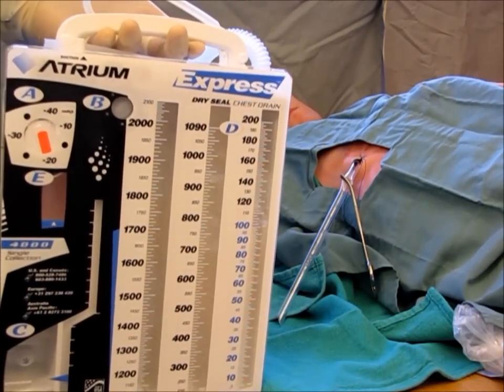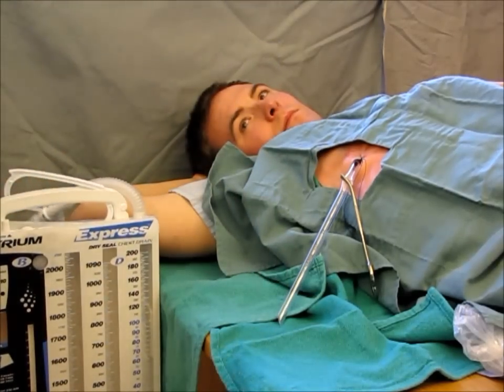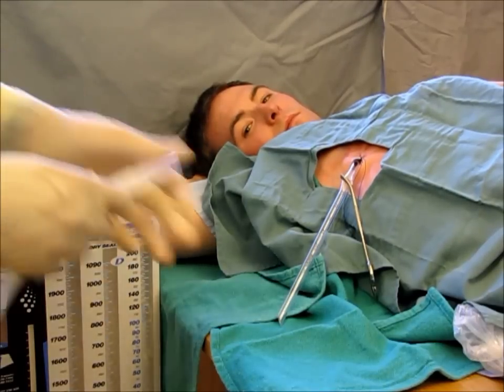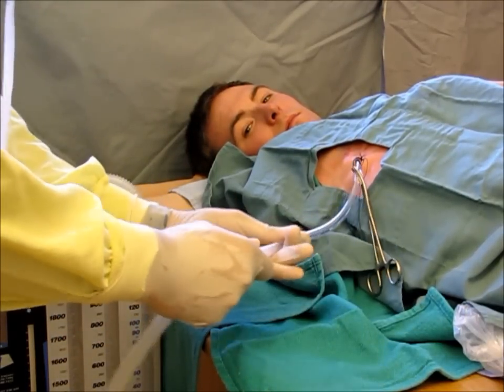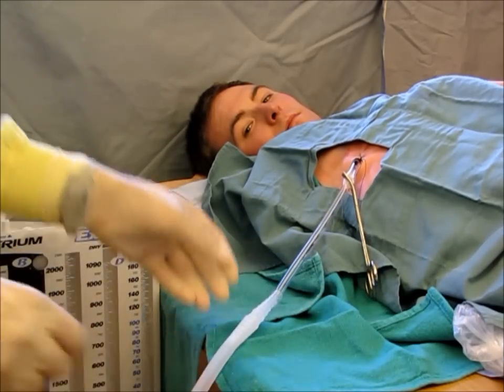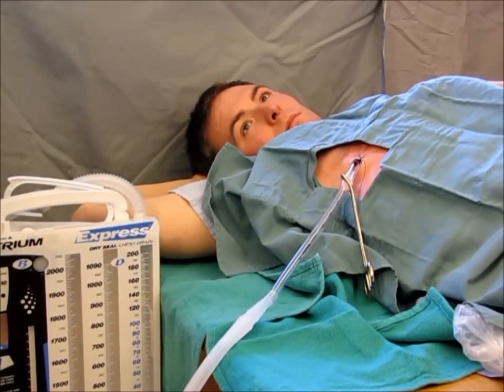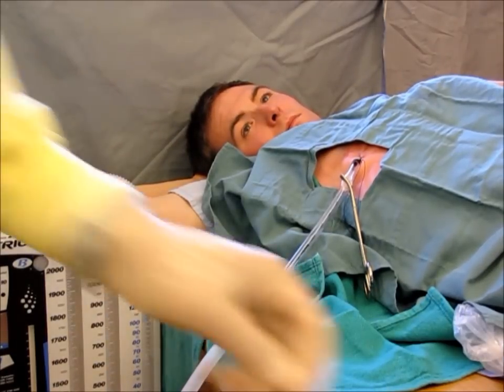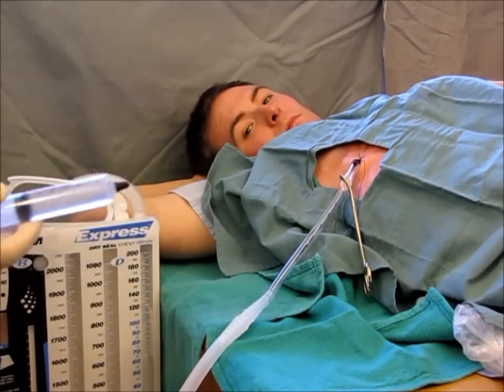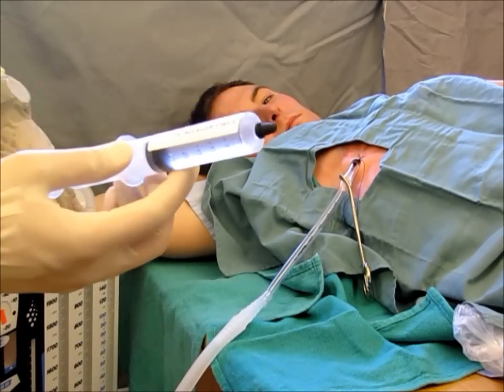Using a standard drainage system such as a pleurovac or an atrium, the first step is to connect the reservoir to the chest tube. Once connected, you can then connect the suction to the wall and ensure that the suction is set to minus 20 centimeters of water. Next, you must prep the air leak gauge using sterile water.